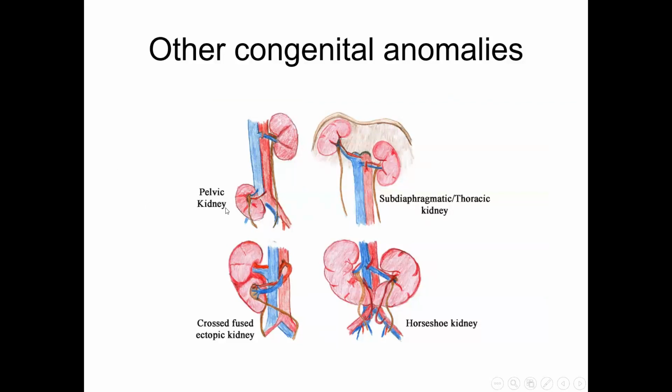Okay, a few congenital anomalies. This is a pelvic kidney. This is a subdiaphragmatic kidney. So these are abnormal locations of kidneys.